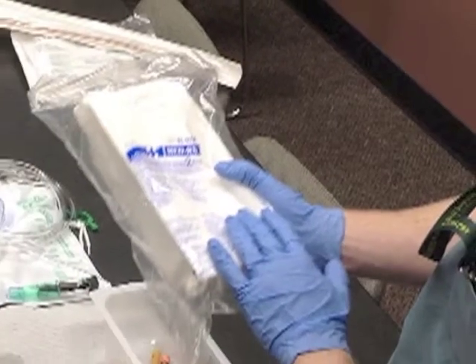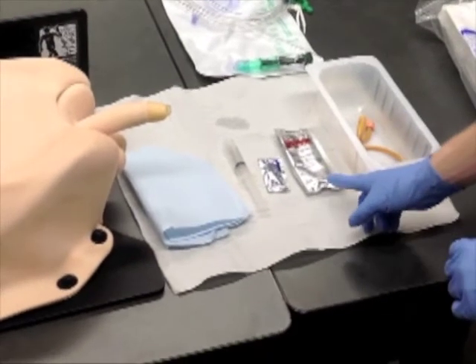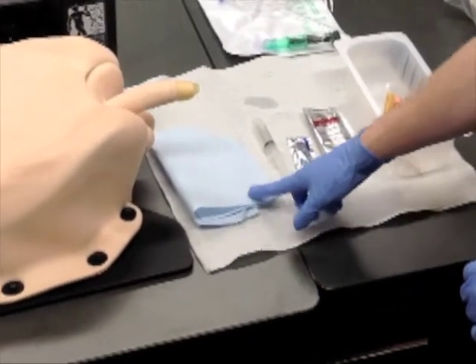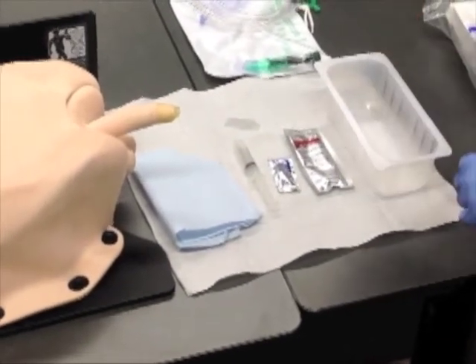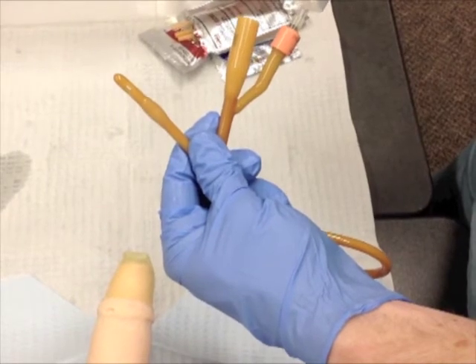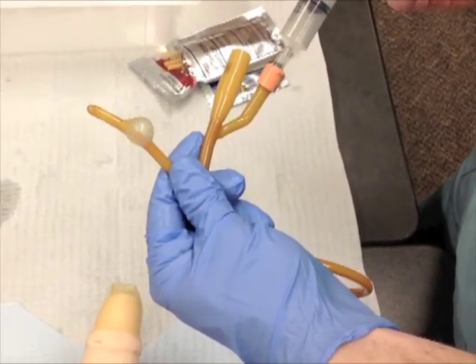In the hospital, you'll often find pre-made catheter sets. These consist of a sterile basin, betadine-soaked swab for prepping the area, sterile lubrication, a 10 cc syringe of sterile water, as well as drapes. You'll also need to prepare your Foley catheter, a catheter bag, and don well-fitting sterile gloves. Before the insertion of the catheter, inflate the balloon with the 10 cc syringe to ensure the balloon port is patent and that there are no leaks within the catheter's retention mechanism.